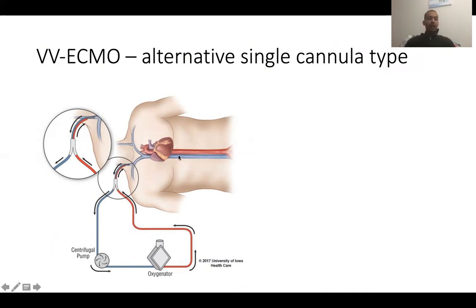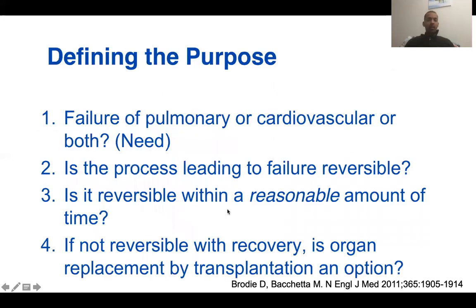Whereas the bad deoxygenated blood is being pulled out by two ports. One is in the IVC, one is in the SVC, and then gets into the cannula. Okay, and later I'll be showing you a beautiful video that depicts this very nicely.